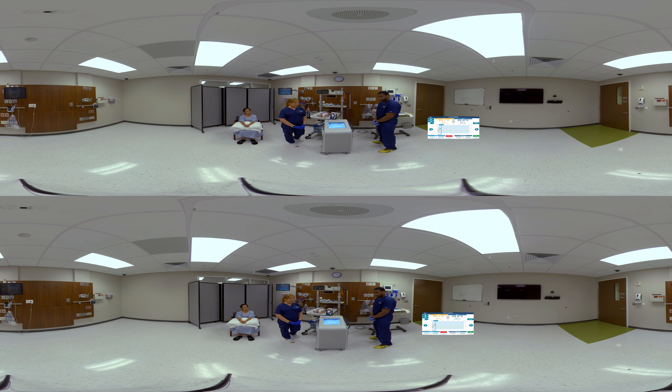Once therapy has started, you will see your patient temperature in yellow and your water temperature in blue. Over time, the therapy graph will start to populate. The dotted yellow line is the target temperature, the solid yellow line will be the patient temperature, and the solid blue line is the water temperature. Once your patient reaches the target temperature, you will see the countdown to zero, and then you will get either a notification or, depending on how your device is programmed, it will automatically rewarm your patient according to your protocol.